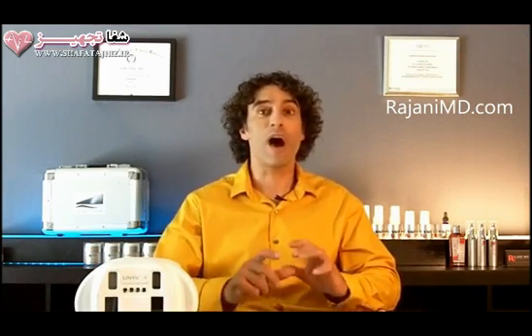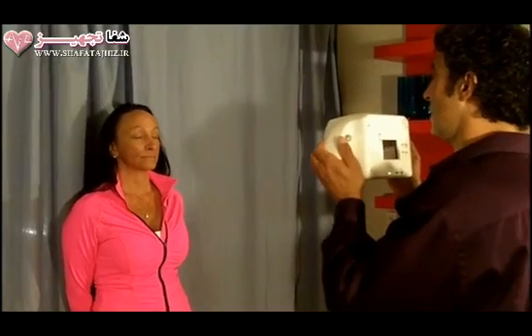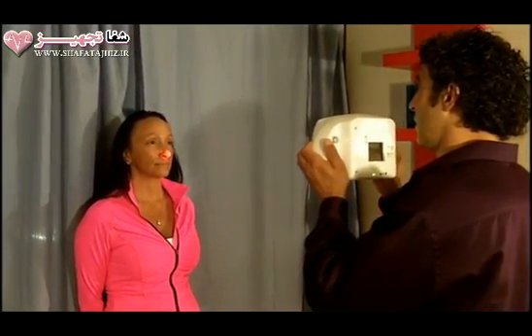I want to show you how I use it in my clinic. So let's go to the video and I'll show you my setup and consultative process and some of the capabilities of the device. So here I'm obtaining the images I need.